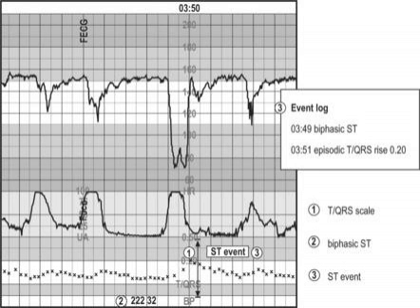As I spoke about in the last episode, we have been assuming for 60 years that poor outcomes are due to fetal hypoxia, and we have slowly been marching down levels of abstraction until we got to fetal pulse ox. And we have found that even when we can monitor the actual intrapartum fetal oxygen saturation, we still cannot accurately determine which babies will have a low pH. And we know from the last episode that not even pH correlates well with outcomes.